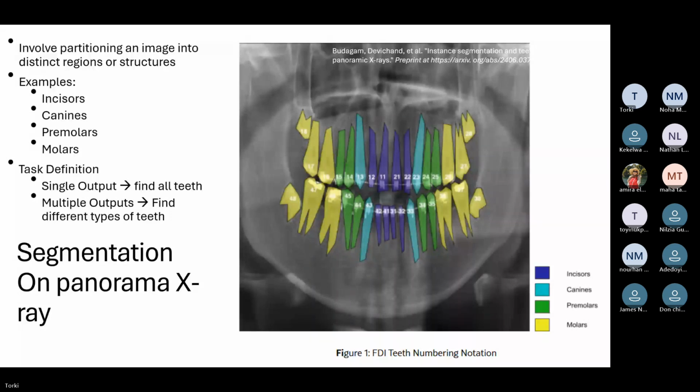So you give the model an image, assuming this is the ground truth result, and your model will produce some masks. They might be correct or might not be correct. If the overlap between the predicted masks and the ground truth mask is relatively high, then this is good segmentation. And this is the metric that we use to compute the overlap.